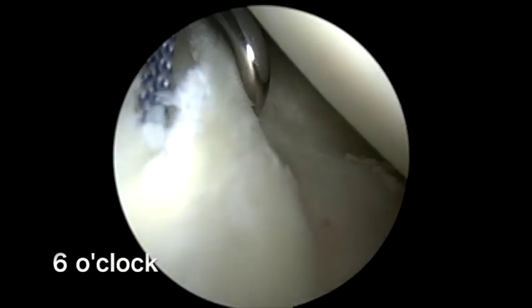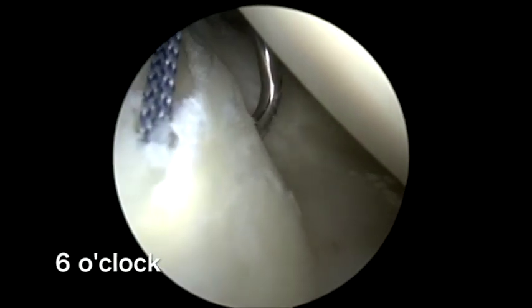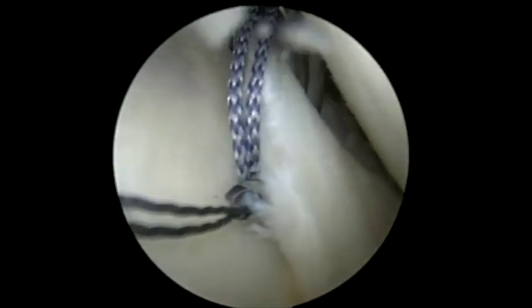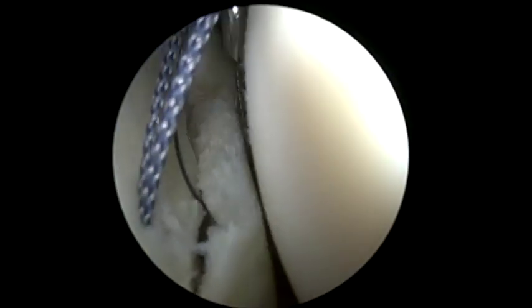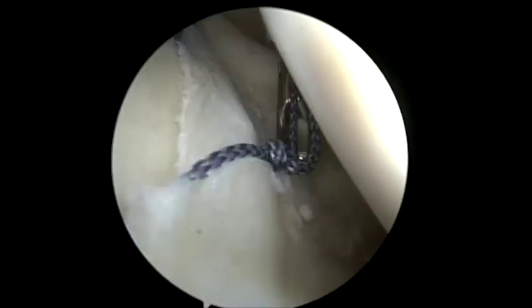While grasping and pulling the anteroinferior capsulolabral complex up, the suture is passed through the IGHL complex with a 5 mm width using a suture passer. The relayed sutures are then tied with a sliding knot and 3 half hitches.